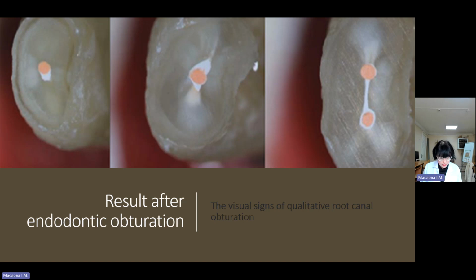In a comparison of the leakage of 4 filling techniques, it was found that Endotec's warm lateral produced significantly less leakage than lateral condensation.